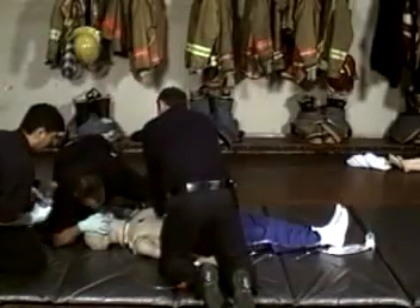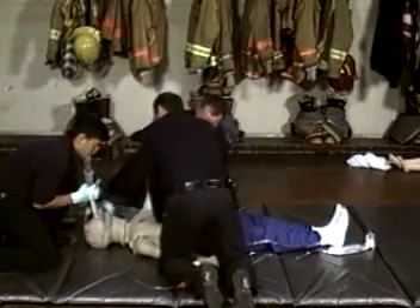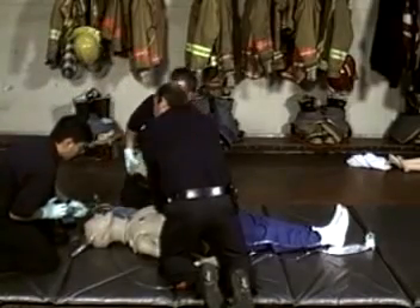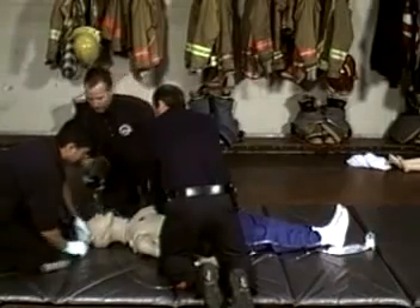Thank you for your interest in the LifeForm crisis mannequins. This video is intended to demonstrate the features of the LifeForm crisis mannequins that will help you train your students to be prepared, make the correct decisions, and perform procedures properly when faced with various emergency situations.